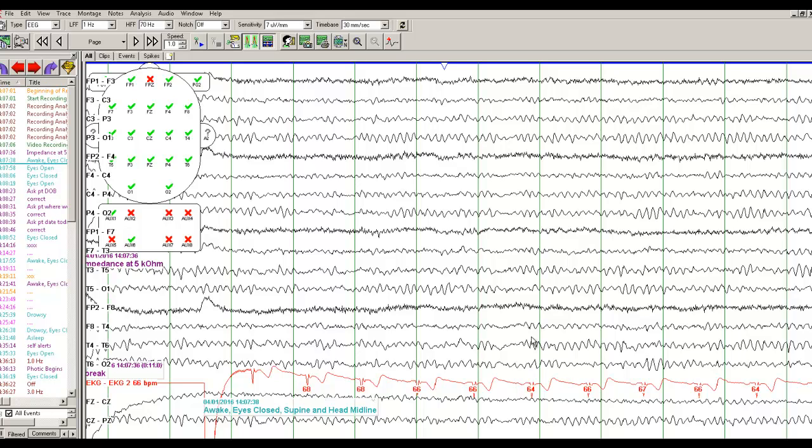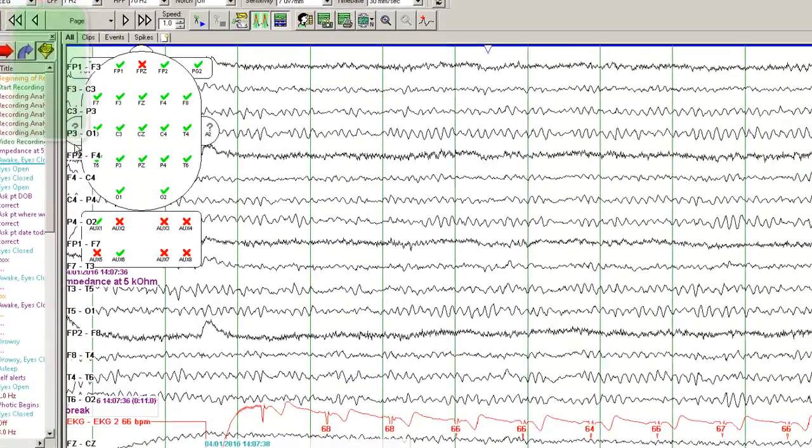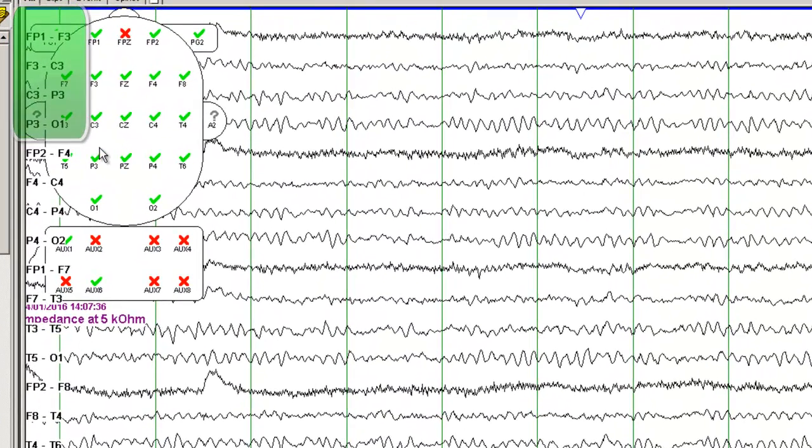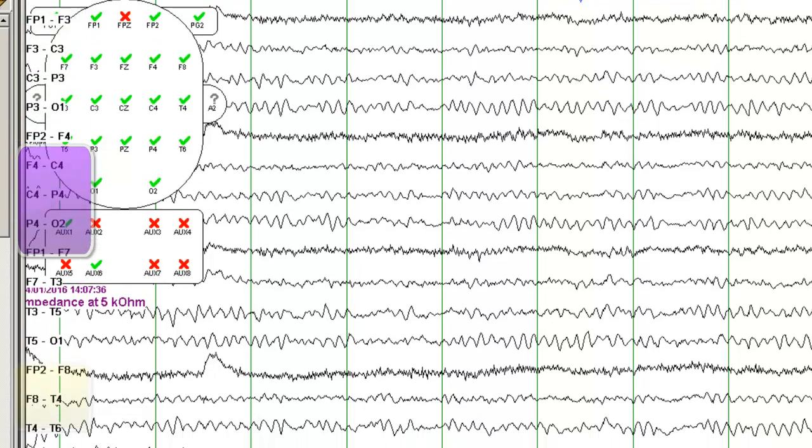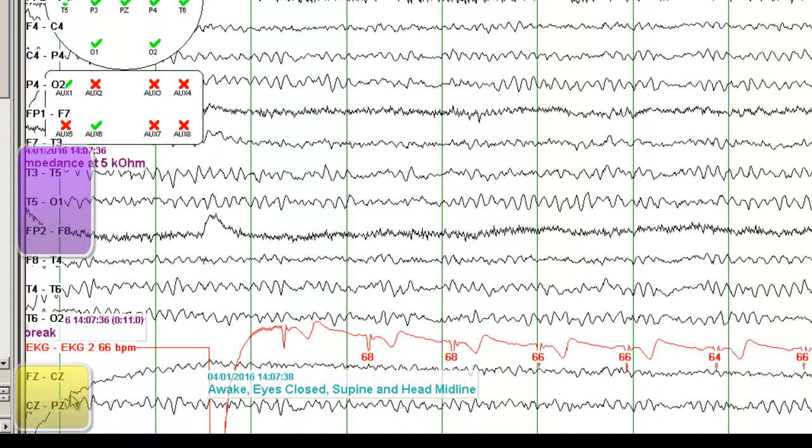Looking at the EEG over here, you are able to identify a well-developed posterior dominant alpha rhythm. Just recall that the EEG, the odd numbers record electrical activity from the left side of the brain, the even numbers record from the right side of the brain, and electrodes that end with the letter Z are recording from the midline.